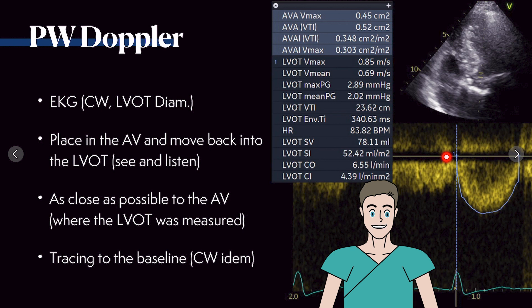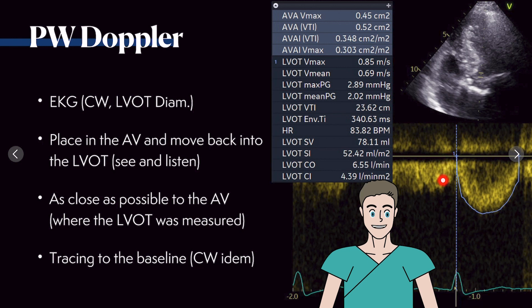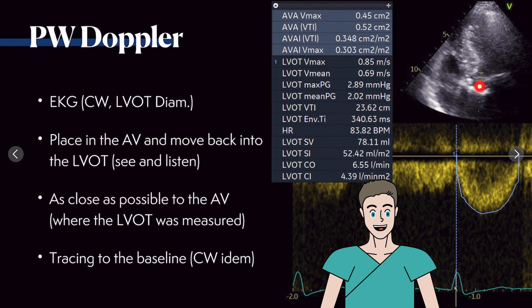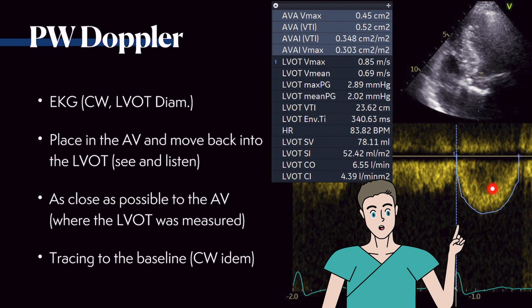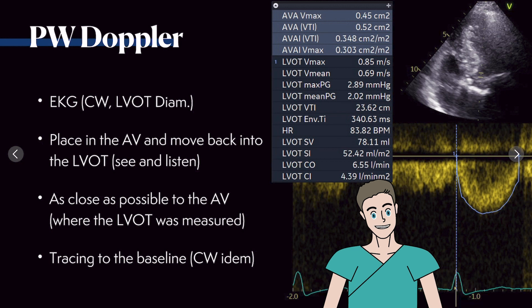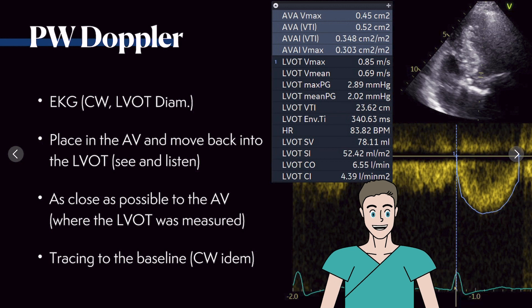How can you optimally place the pulsed wave Doppler? Place it first in the aortic valve — in the middle of the stenosis — because then you have a lot of aliasing in the signal, and then move the sample box back until you no longer hear the aortic stenosis. So it's a see-and-listen approach. When the signal has a darker area below and looks correct, that's probably the LVOT. When you move back to the LVOT, you hear a distinctly different signal.